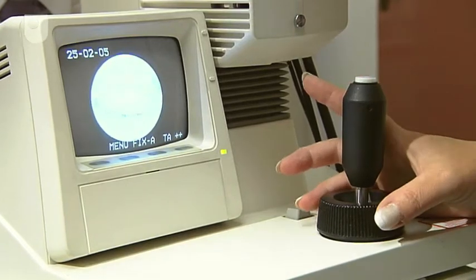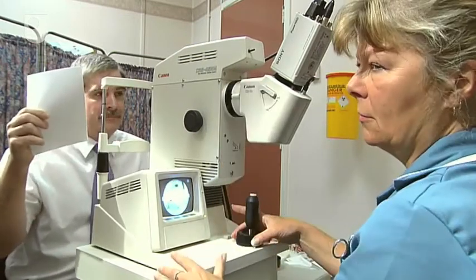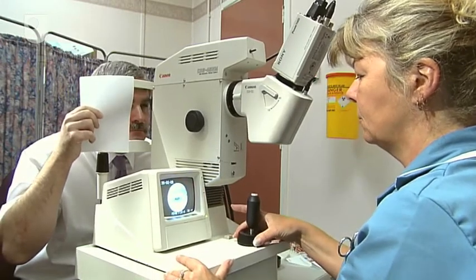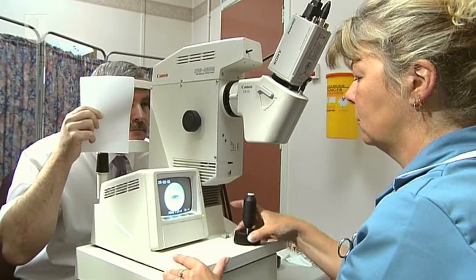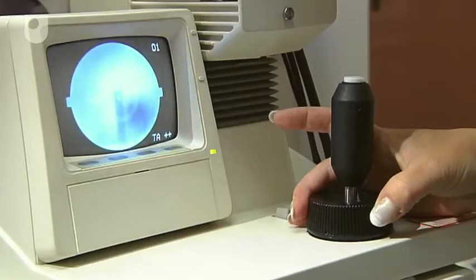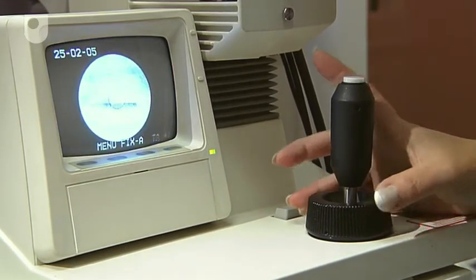And if you can focus on the light again. And that's the first one. I'm getting some good shots of the eye. Can you try and open your eye a bit wider for me? Thank you. If you can. That's brilliant.